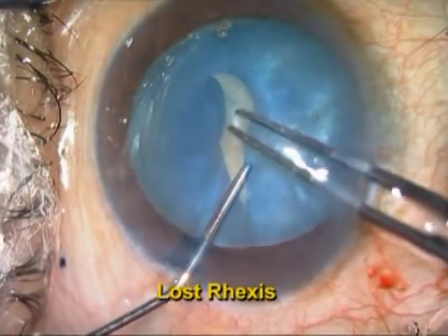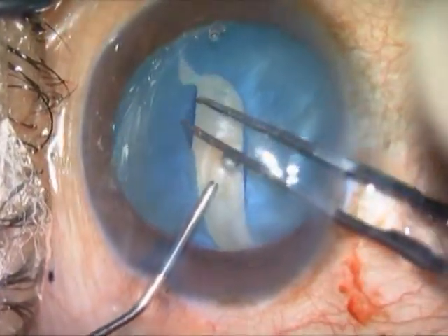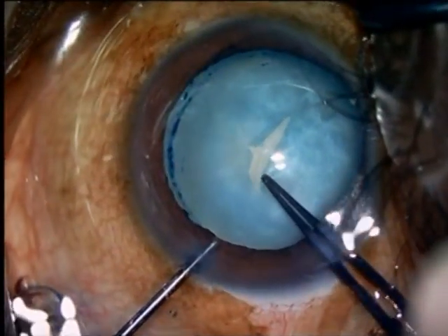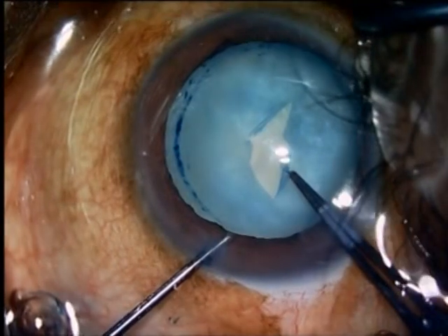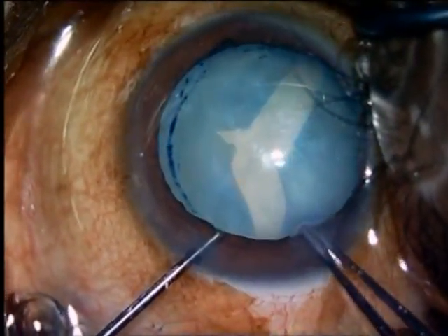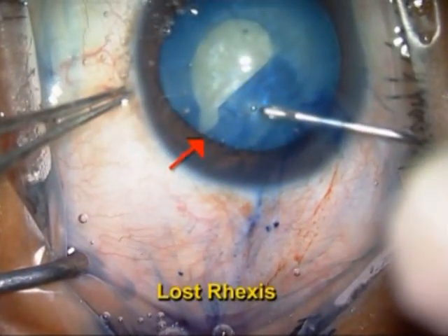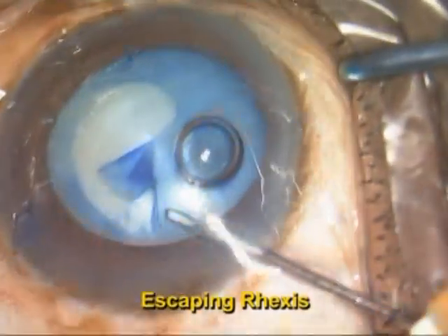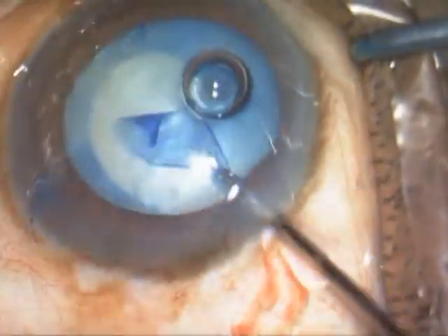White intumescent cataracts are a very common problem in a country like India. The main problem associated with white intumescent cataracts is very high intralenticular pressure, which makes the rhexis very difficult. The Argentina flag sign, wherein the rhexis gives way in two directions, is not uncommon in white intumescent cataracts. This Argentina flag sign can be prevented to a large extent by certain maneuvers, which I am going to show you in this video.